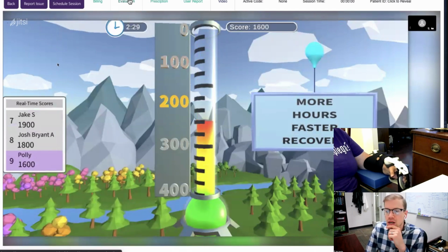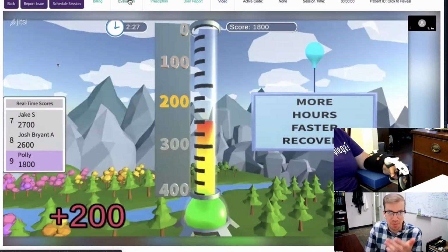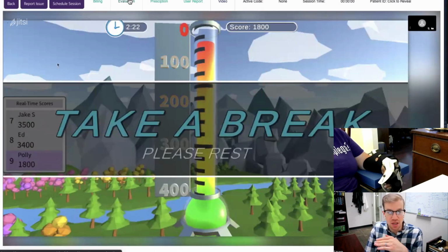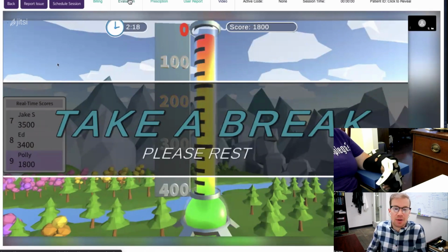And so while the simple idea is that it's just a passive exercise here where you're just stretching and warming up, it actually turns out to be better if we can have some more active engagement of those extensors. So I very much encourage you to do that.